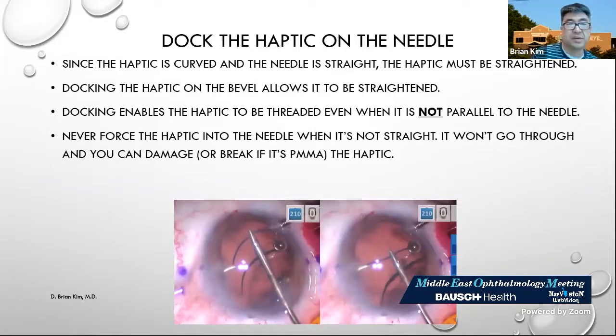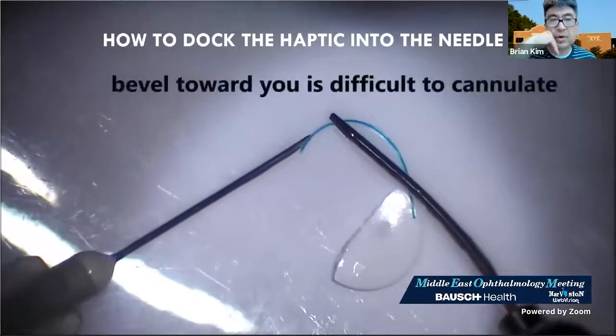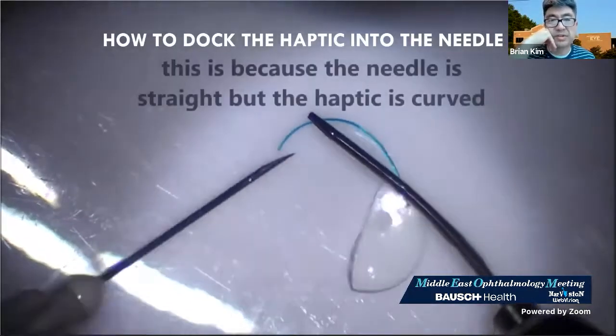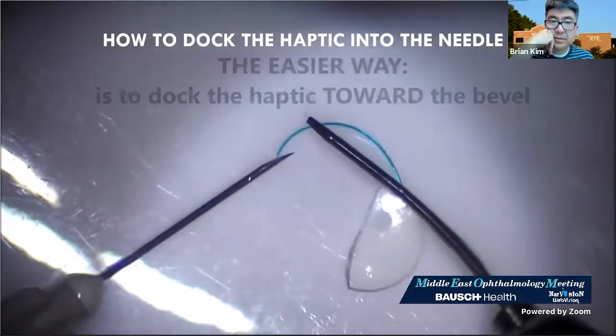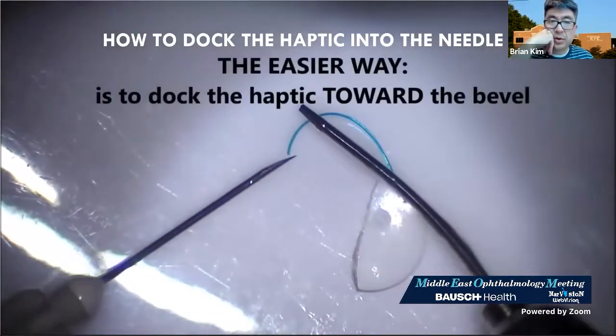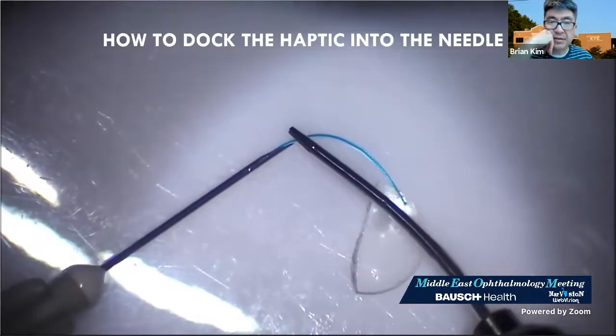And so that's essentially what I said here. With the PMMA haptics, definitely, if you are too aggressive with this step, you will bend the haptic, and it's going to be very difficult to fix that problem. And so it is very important to be very gentle in this step. So here the bevel is up, it's not working. Bevel is towards you, it's not working. Bevel down, but then bevel towards the haptic here, you can dock the haptic towards the bevel, flatten it out, straighten it out, and then you can advance the haptic in the needle.